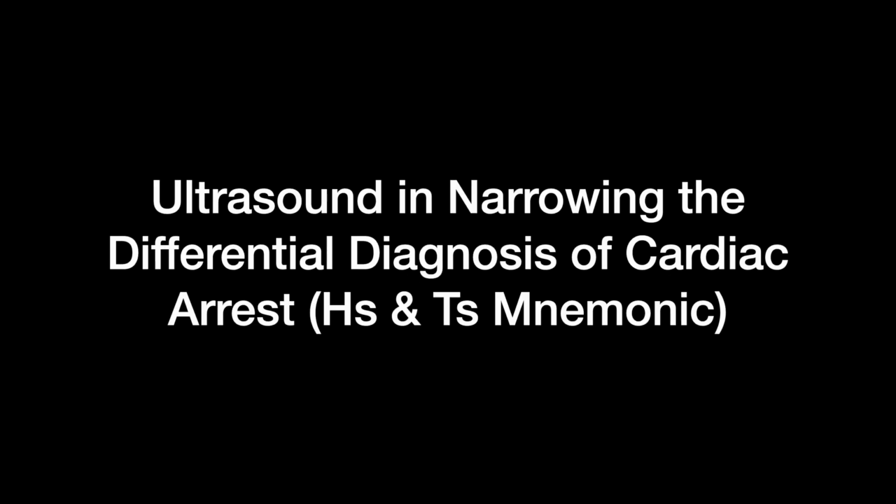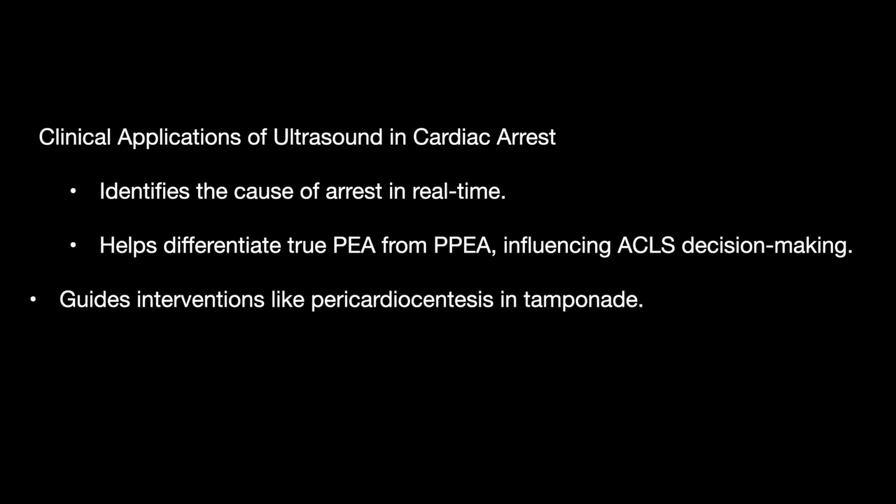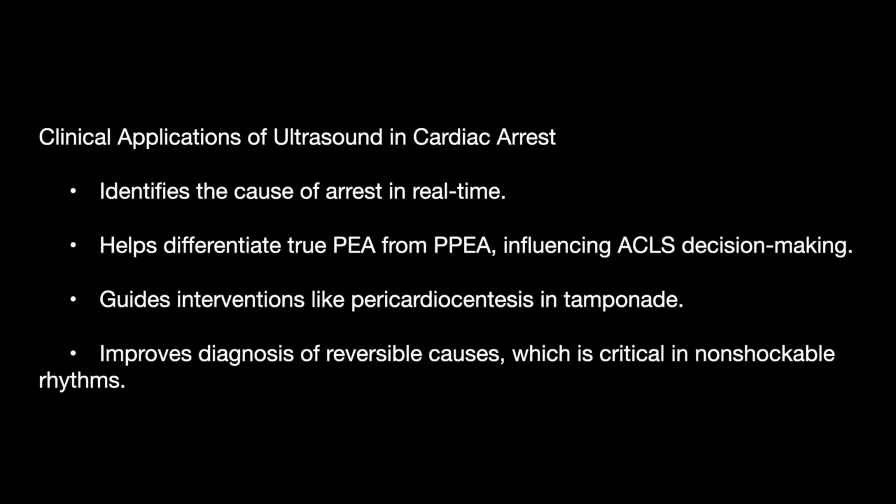So how can we use ultrasound in narrowing the differential diagnosis of cardiac arrest, that is, the 5H and the 5T algorithm that we use? The clinical application is to identify a cause among the 5H, 5T, help differentiate true PEA from pseudo-PEA, guide interventions like pericardiocentesis in tamponade, and improve diagnosis of reversible causes, which is critical in non-shockable rhythms.